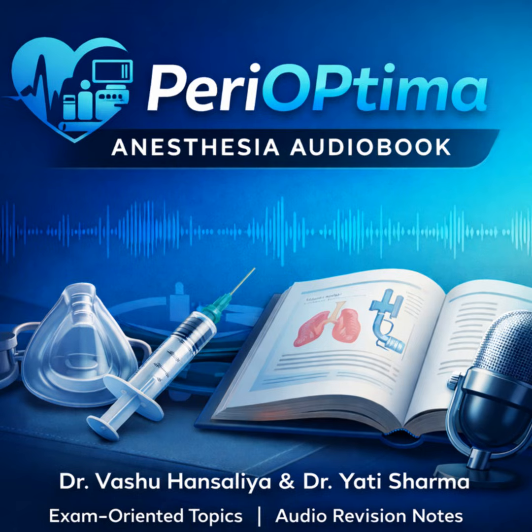The clinician dials a 75% N2O, 25% O2 mixture. A standard mix. A very standard mix. The hypoxic guard linkage works perfectly. It opens the valve labeled N2O 3 times as much as the valve labeled O2. The machine physically delivers a 3-to-1 mixture. But the gas itself is wrong.